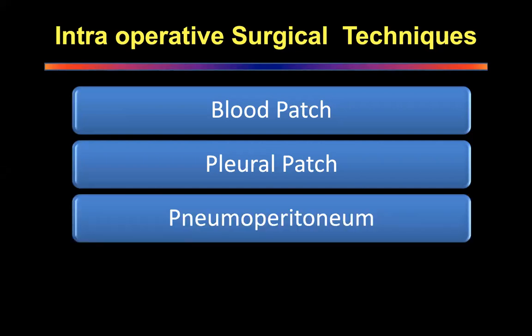You can create a pneumoperitoneum. This is especially useful when you've done a lower lobectomy and you're worried that the lung will not expand. Then you can put a Veress needle into the abdomen and put in 500 ml of air, and that will temporarily lift the diaphragm up and give you approximation of the diaphragm to the base of the lung. The air resolves by itself, and gradually everything will settle down with time. At least the air leak stops because of pleurodesis.